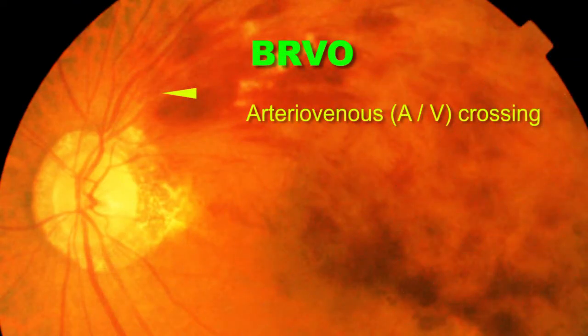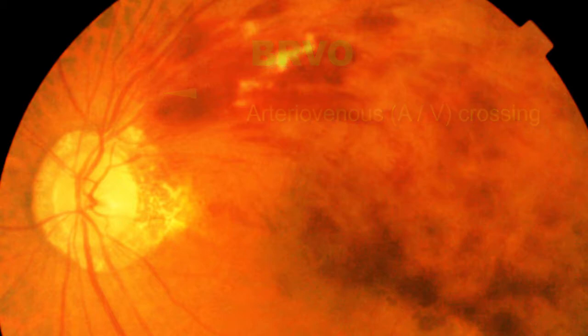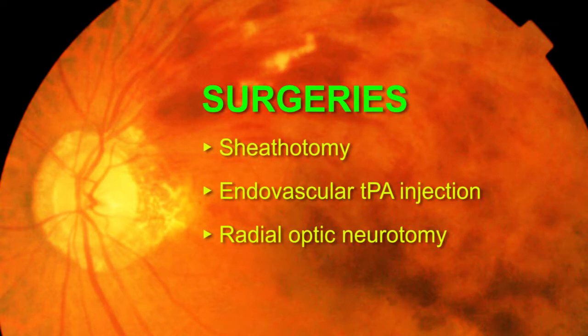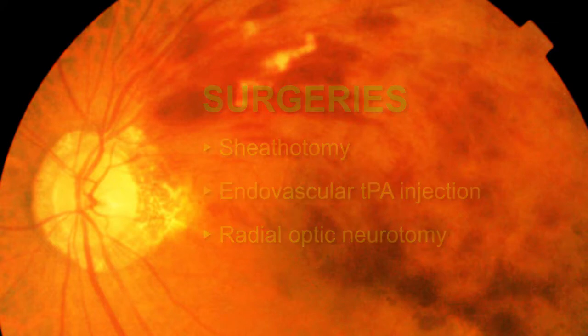Retinal vein occlusion is one of the common causes of visual impairment. The occlusion in BRVO commonly occurs at arteriovenous crossing, whereas in CRVO it typically occurs at the lamina cribrosa. There have been several attempts to treat this disease surgically. Current available treatments including sheathotomy, endovascular tissue plasminogen activator (TPA) injection, and radial optic neurotomy have their limitations.